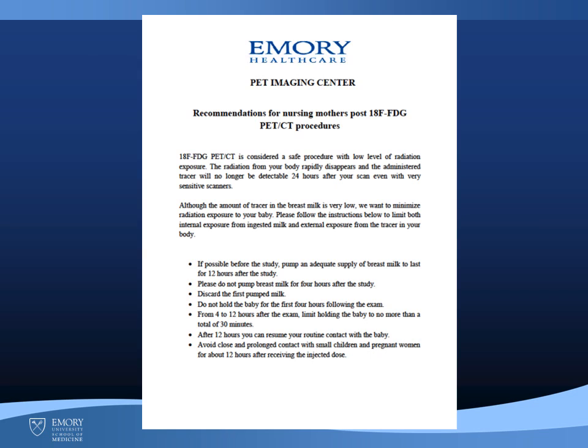And in fact, we give the patient special instructions when they are lactating, even though the FDG does not get into breast milk in any appreciable quantity. We do not want the patient to hold their infant up to their breast so soon after getting a scan. So we have a kind of a graduated exposure over 12 hours. And we also tell the patients to pump before the scan.